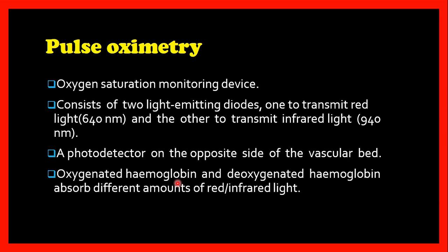Correct. But still, the pulse oximeter doesn't have a predictable diagnostic value, as the sensor size and shape should conform to the anatomy of the tooth that we are using, and also in cases where we have coronal calcification, the results may vary.